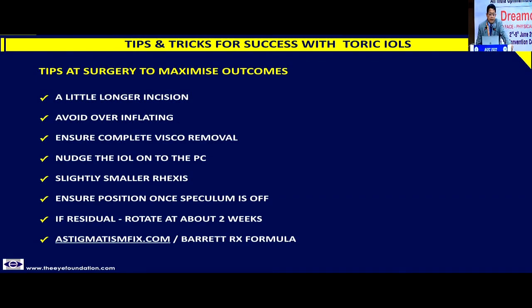The final slide. During surgery, make a little longer incision so that you have a very stable anterior chamber. Avoid overinflating because if there is too much fluid, then the lens tends to rotate.